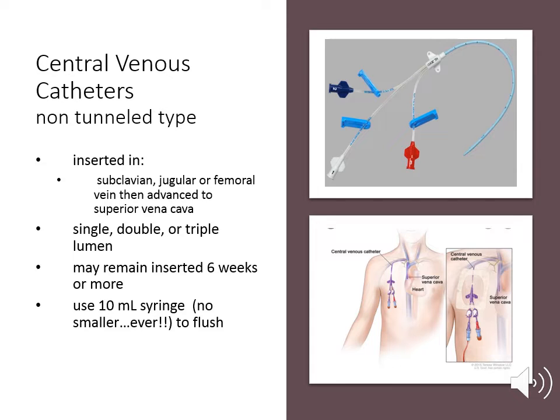Clamp as you are infusing the last ml of solution. This prevents negative pressure, which can draw blood into the catheter and then sit there until they use it the next time. So when you're using that push flush method, when you get to the last ml is when you want to clamp it.